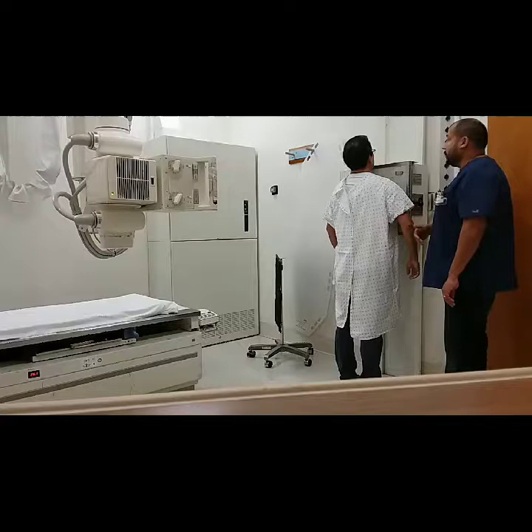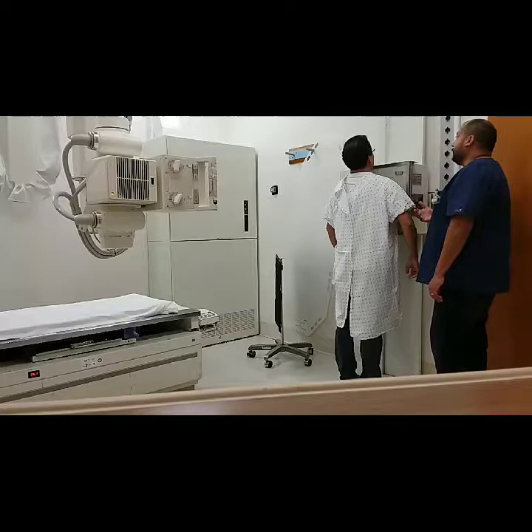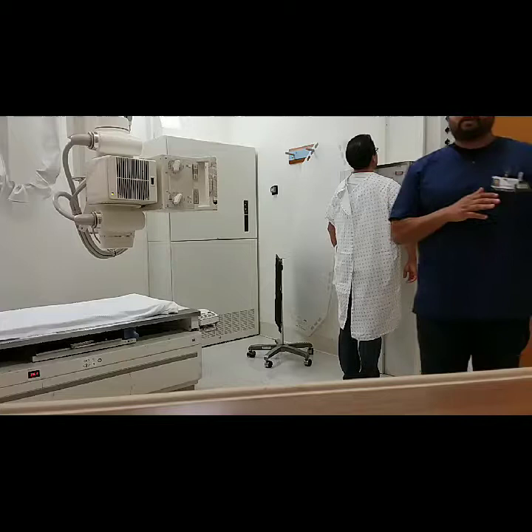I'm going to instruct our patient to take two deep breaths, and on the second breath he's going to hold it. Mr. Chen, can you take two deep breaths for me? Let it out — go ahead one more time, and suspend that breath, then we'll take the x-ray. I'll give the instruction from behind the wall: take a deep breath and hold it.